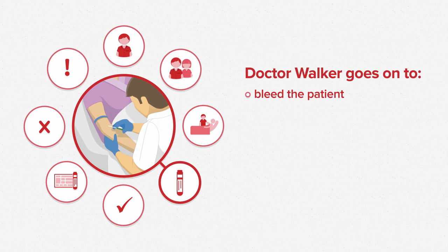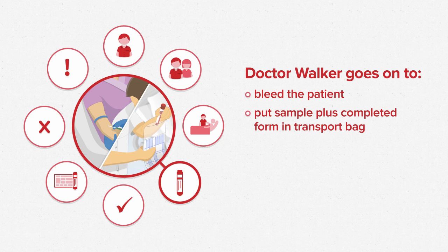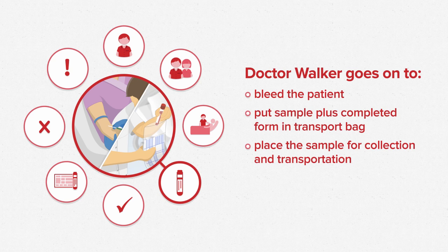He goes on to bleed the patient and returns to the doctor's room where he puts the sample and completed form in a transport bag. He places them for collection and transportation to the hospital transfusion laboratory.